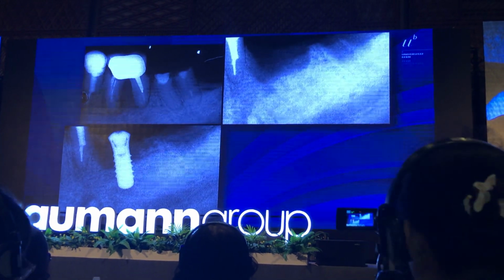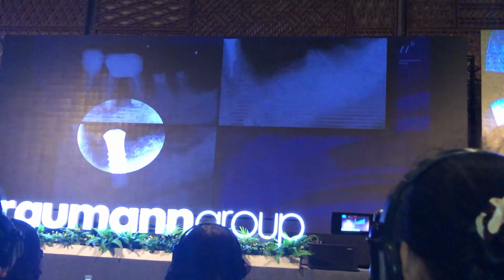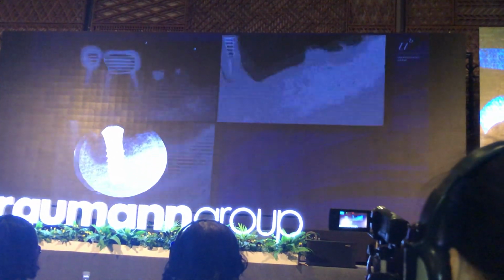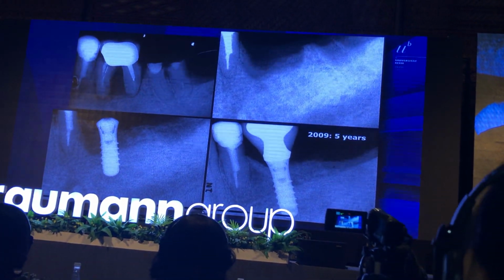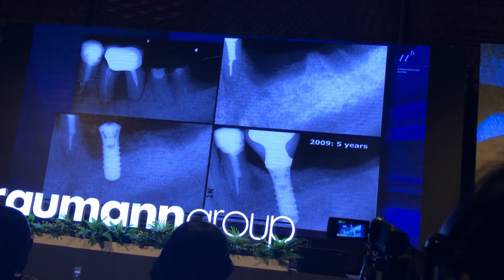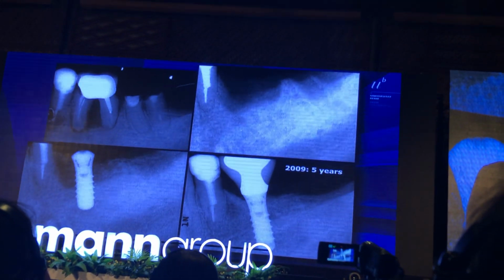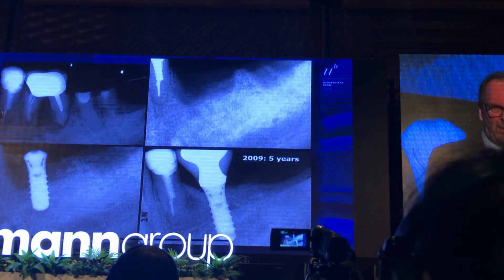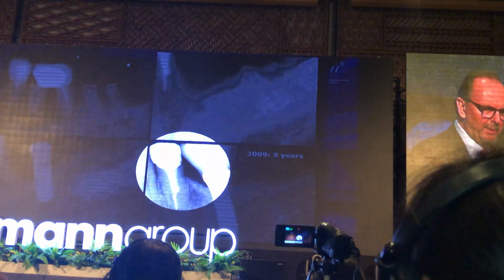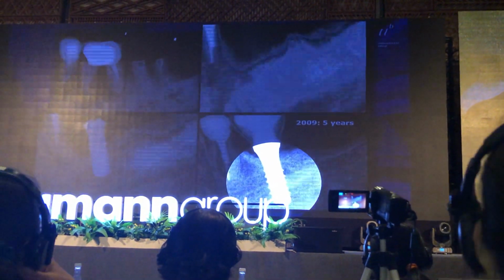These are the radiographs I showed you before. That's how we started. Then before we put the implant in, this is then the 3 months post. Now have a look here, 5 years. It's amazing. That's Mother Nature. So the remodeling has completely brought back the mineralization in the bone. So the bone is now mineralized. So it looks like normal now. So I was really pleased to see that. How much the Mother Nature has remodeled that bone. So now the defect is completely gone.